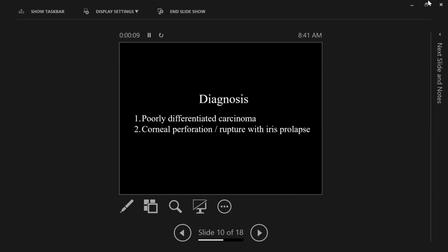So yeah, the neoplasm was probably what caused the corneal perforation or rupture that they remarked on clinically. This is a neoplasm that could recur locally. This is a neoplasm that could metastasize, typically first to local lymph nodes if it does metastasize. So a case of sort of periocular thick tan tissue, this time that was neoplastic.